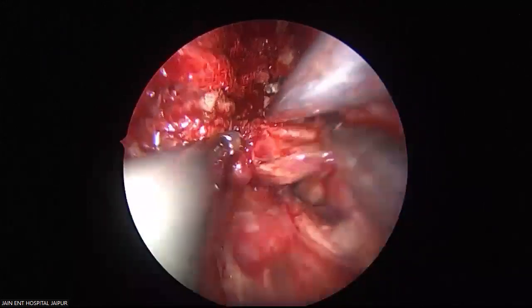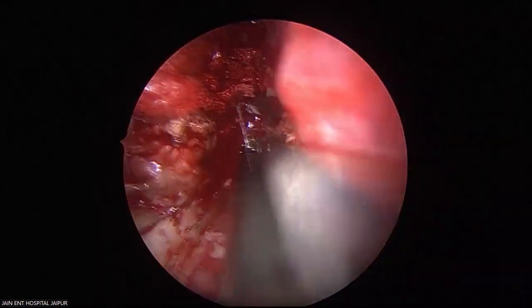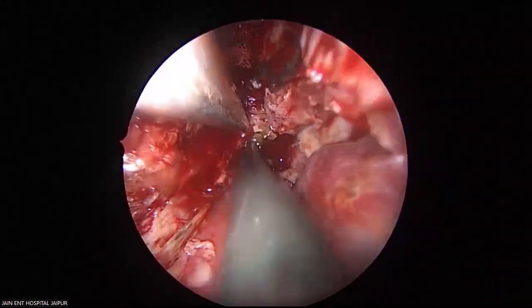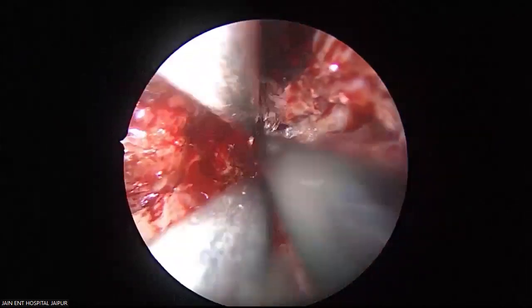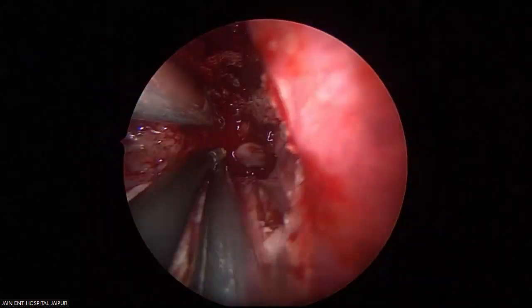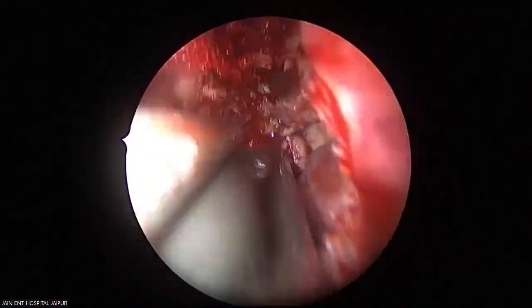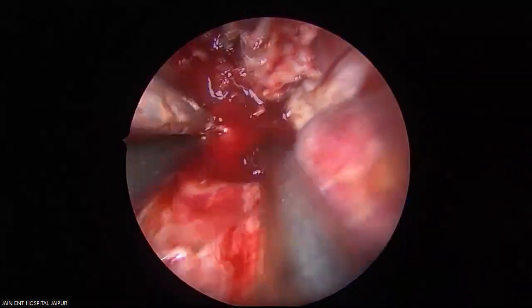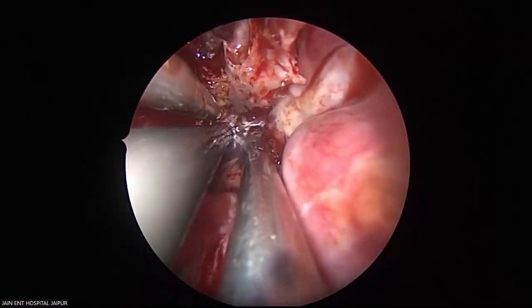See, this entire component has been pushed down. Can you see the nasopharynx? Yes, yes. You will now remove the medial part from the oral cavity. See this bang on the bone, subperiosteal. See this mucosa, periosteum. It's tenting. See this periosteal attachment?